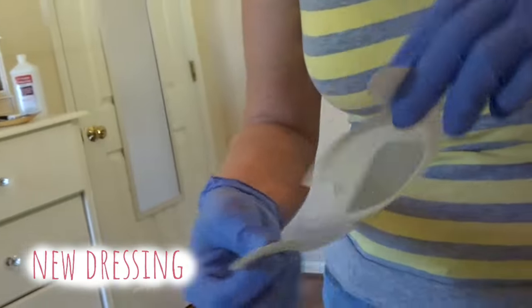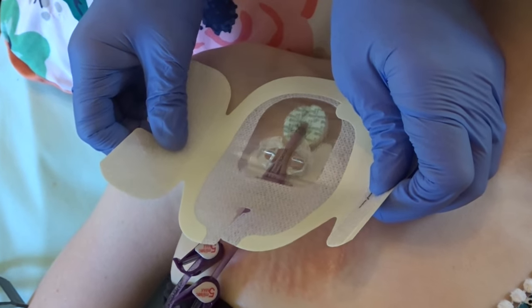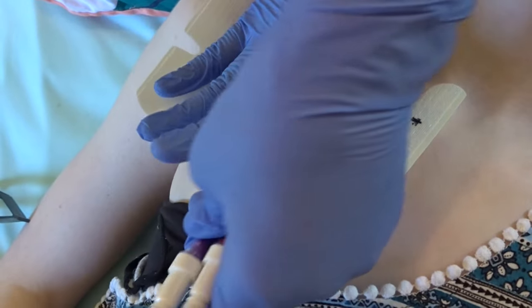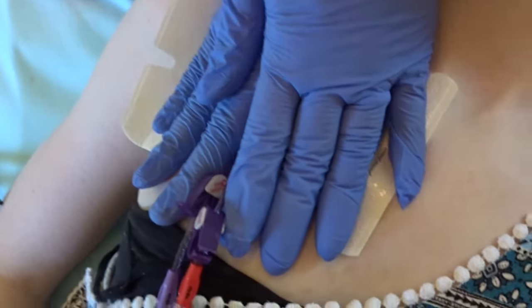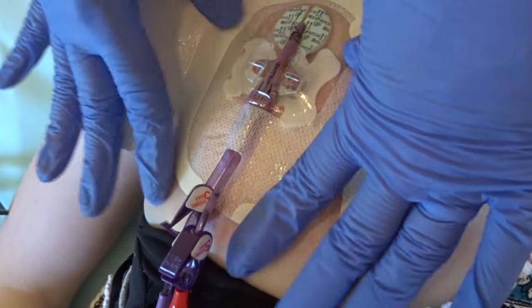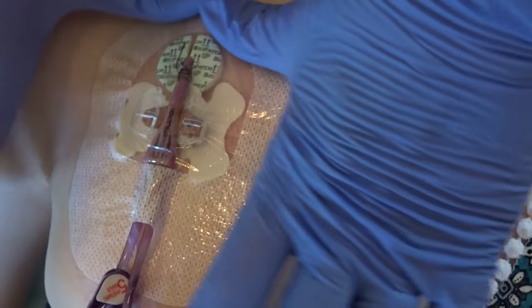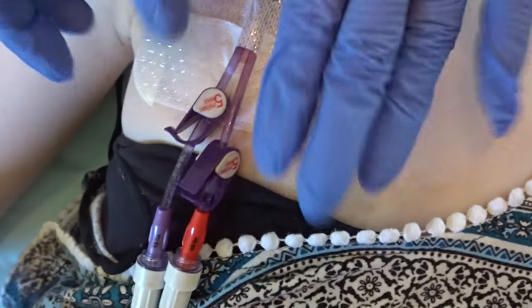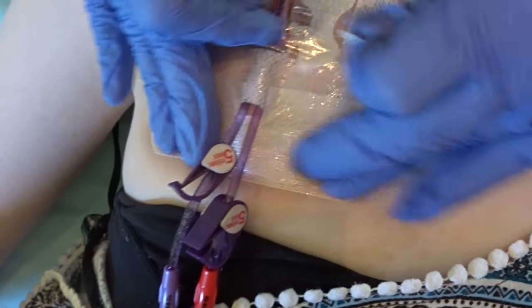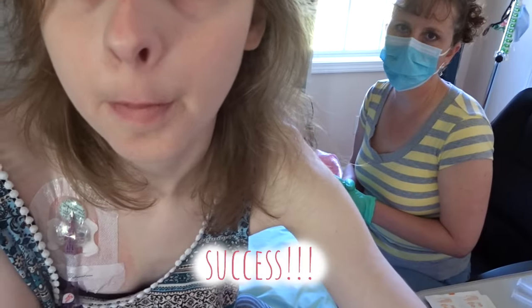Lastly, take the new dressing from the sterile field — that is the portion that will be on the skin. Center the window of the dressing over the line insertion and bio patch site. There is an exit area for the lumens. Hold for 30 seconds or so; the heat allows the dressing to stick to the skin. The paper area on the top portion has the reinforcement pieces of the dressing — the larger goes under the lumens and the smaller piece can be placed on top. Typically, this is where you would write the date that the dressing change was completed. And the dressing change is a success.